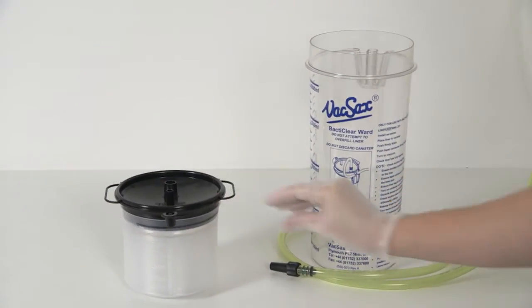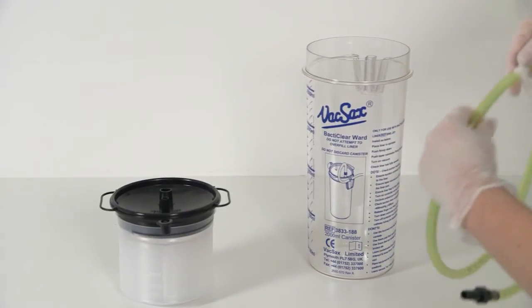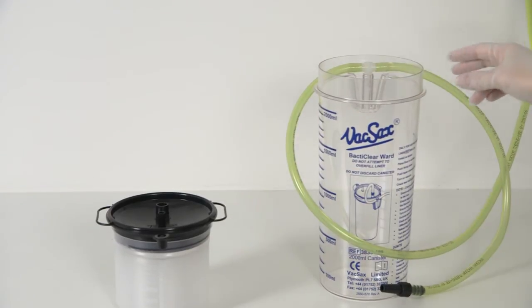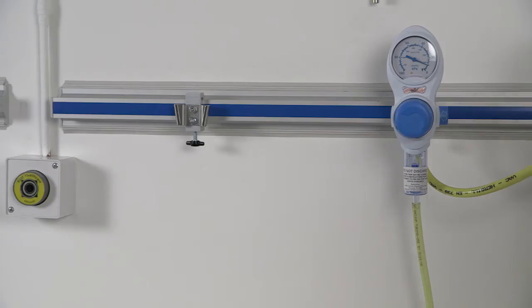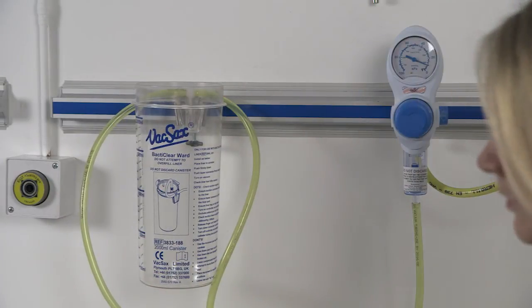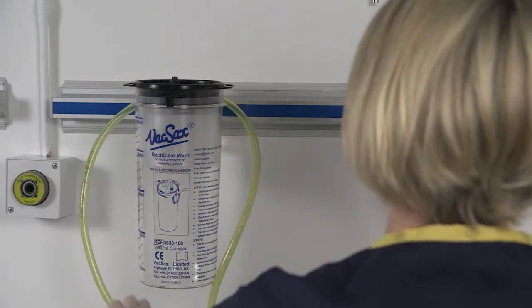Taking the yellow non-disposable vacuum tubing, insert the T-piece vacuum connector located within the tubing kit itself and press firmly into the port situated at the back of the canister. Start by placing the 2L canister into the wall bracket. Place the BactiClear liner into the canister and press home firmly.